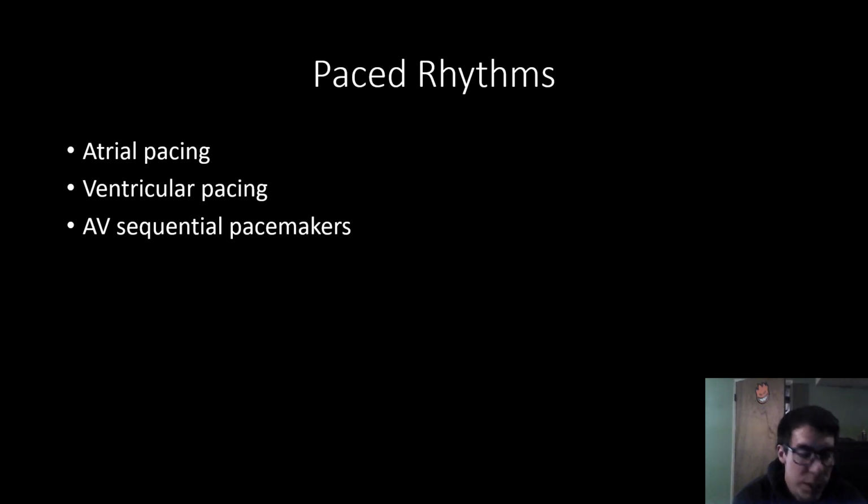So you have a pacemaker that will go off sometimes, when needed, to stimulate the atria to contract, which will then stimulate the ventricles. Whenever the pacemaker initiates that electrical beat in the atria or SA node, it'll then travel down its normal pathways to the ventricles, which work fine, and then they'll conduct the impulse through them. So those are just atrial ones, which are called atrial pacemakers.